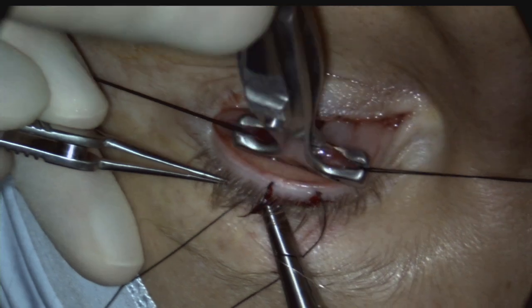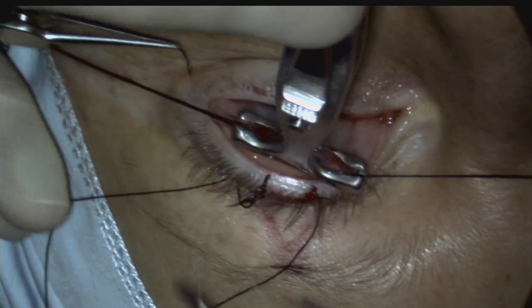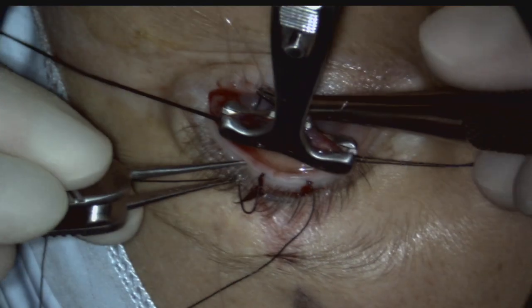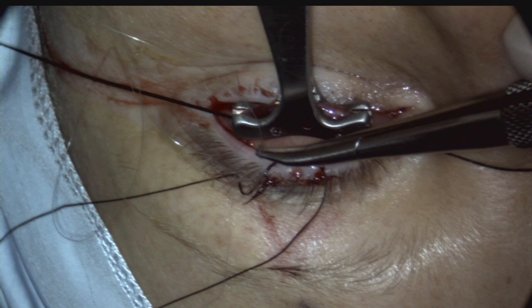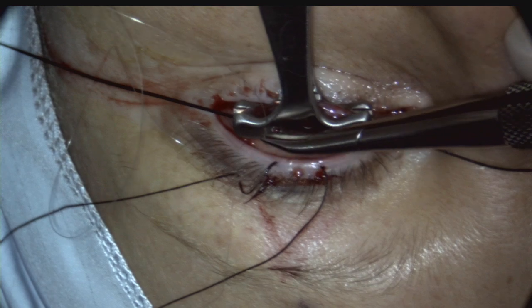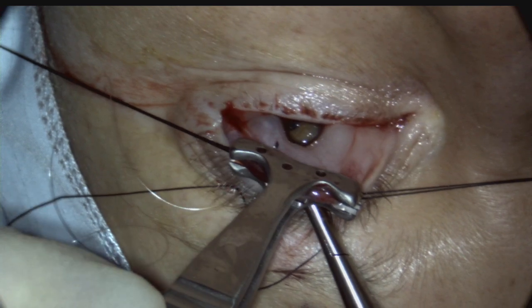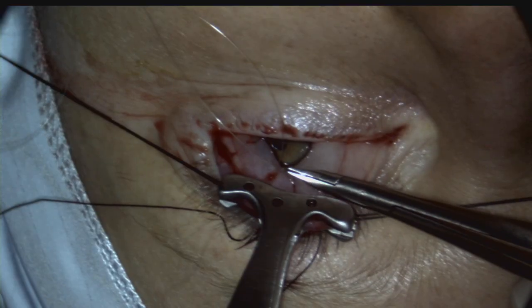A 6-0 monocryl mattress suture is placed, starting laterally and externally at the skin crease before being brought forward through to the conjunctival surface. The suture runs in a lateral to medial direction with each bite placed around 1-2 mm apart. Each suture passes through conjunctiva and upper tarsus about 1-2 mm distal to the clamp on one side before emerging on the other side through Muller muscle and conjunctiva and vice versa. A monofilament suture is used, which can be easily pulled through during removal but can also be left to dissolve if desirable.